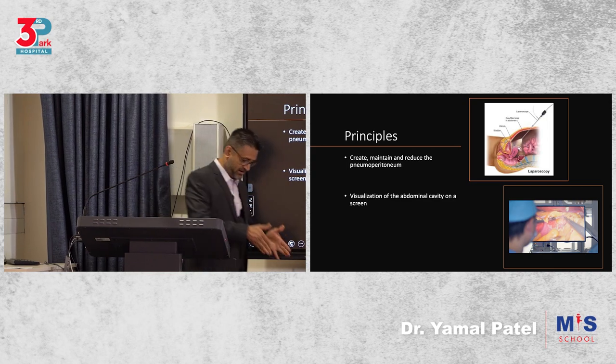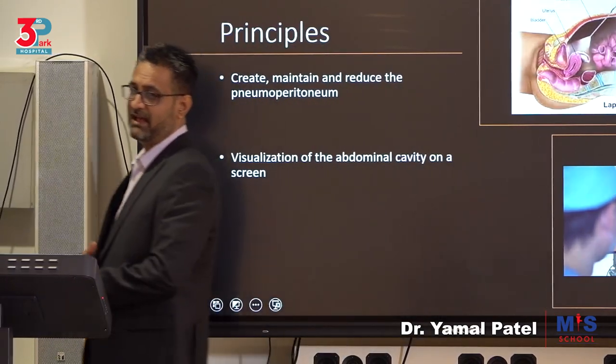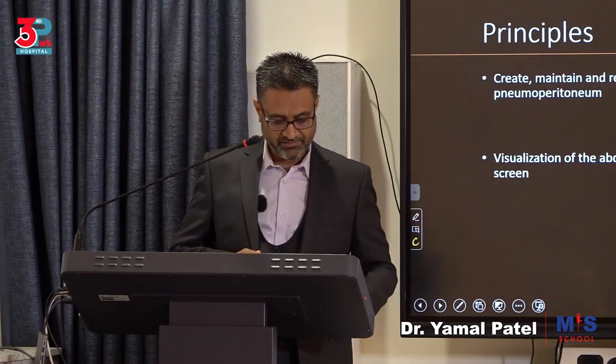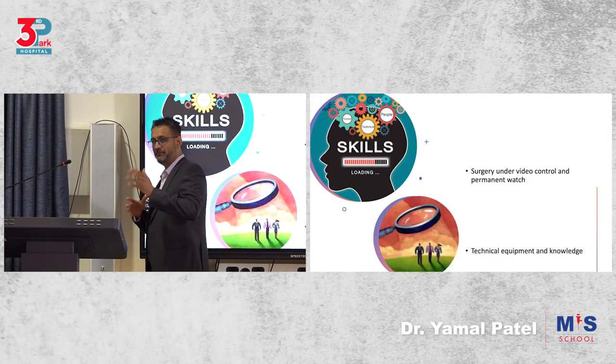The next one is you're going to visualize this on a screen. So it's not direct vision, it's visualized on the screen and operate. So your motor axis and your visual axis will have to be trained to do surgery in that way. That is something we have to keep in mind. We have to keep in mind that surgery in MIS is always under video control and permanent watch.